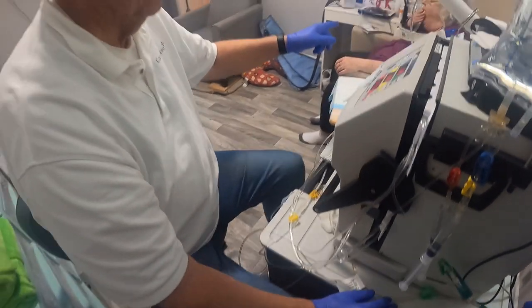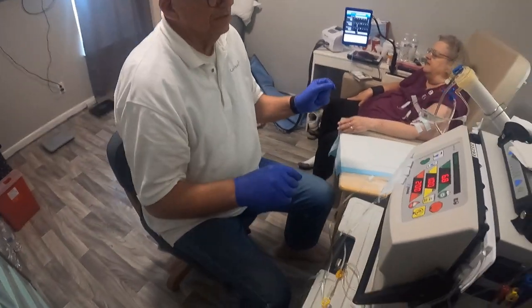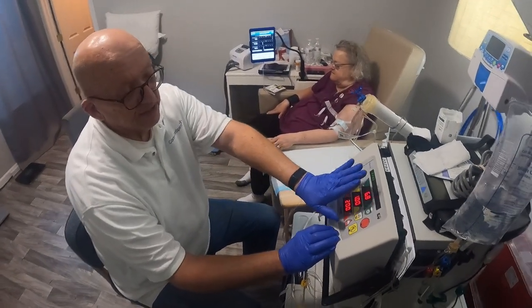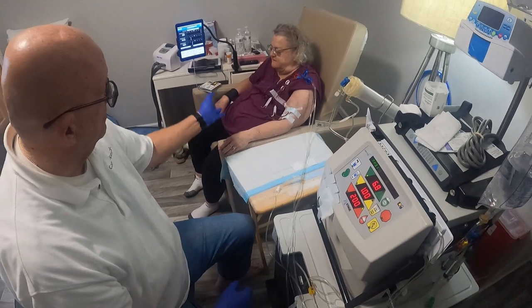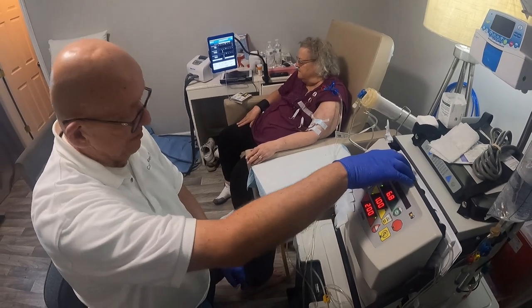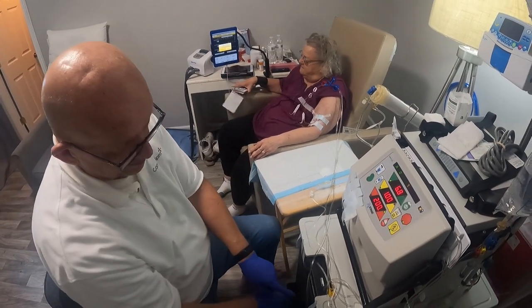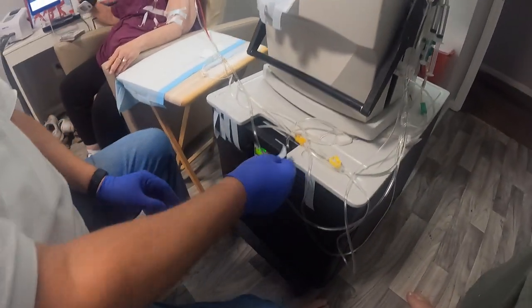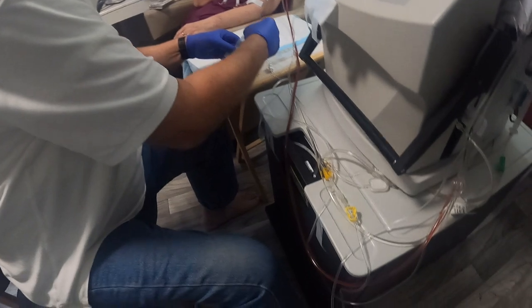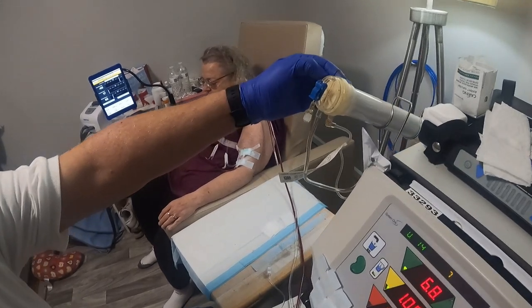She says she's a little woozy. Did you drink anything yet? All right, so now she's already set these numbers. We've got everything set. Push the treatment key. Just go on the pure flow, that starts the treatment. So the pure flow is this machine down here that stores the dialysate. And record blood pressure. Notice that blood starts running down. It'll go in the machine, it'll go through, you'll see it start coming up in this filter.